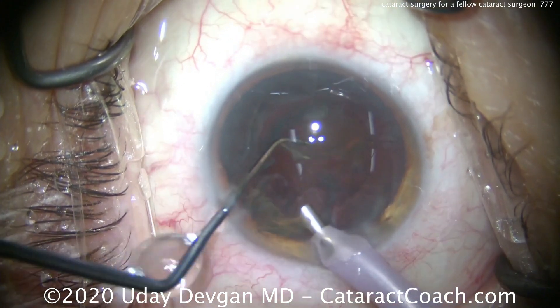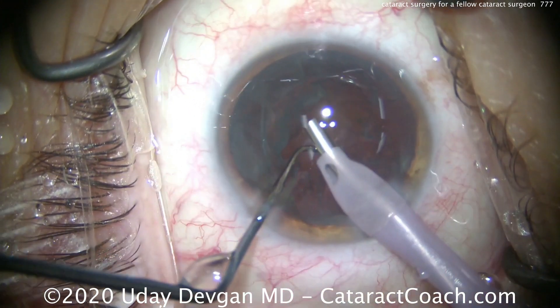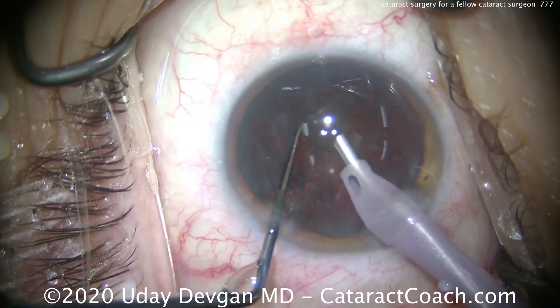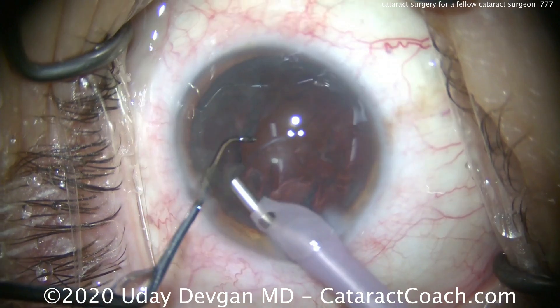This patient has a little bit of against-the-rule astigmatism — very common in this age group. That phaco incision alone is enough to basically neutralize the astigmatism. Taking out the second half of the nucleus — look at the chopper in that safe position. We don't want the posterior capsule to come up. We can get some of this epinuclear shell out as well, or just take it out with the IA probe.